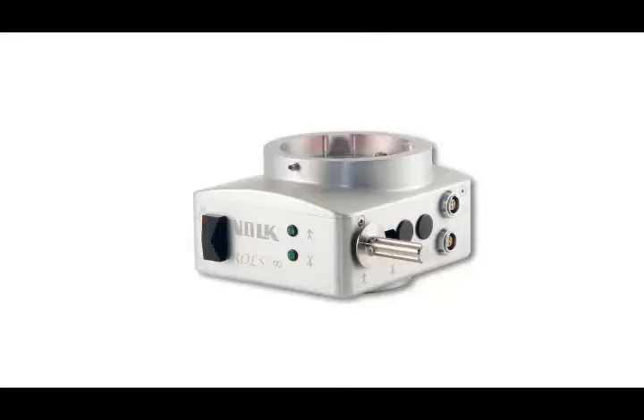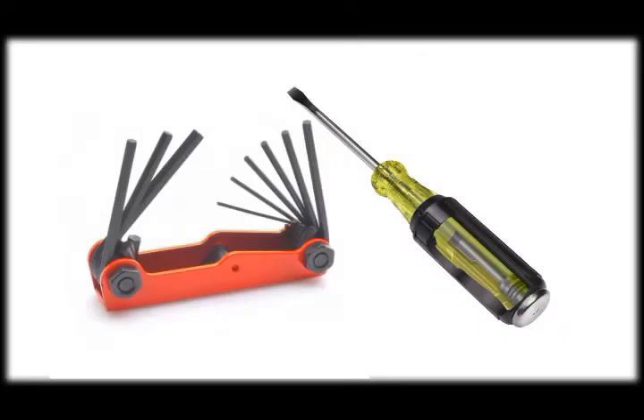If you do have a Rolls Infinity reinverter with an adjustable prism design, it will be helpful for you to refer to the user instructions that came with your device while watching this video. Adjusting the prism of the Rolls Infinity reinverter requires two tools: a standard flathead screwdriver and a 3/32-inch hex wrench.